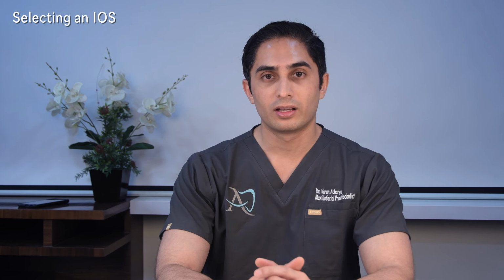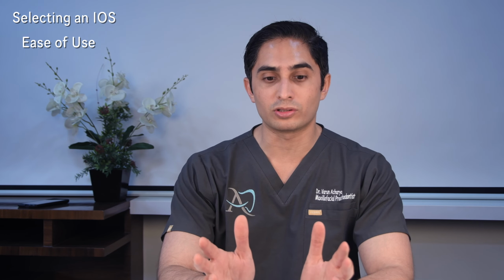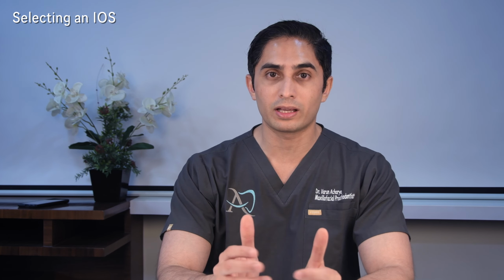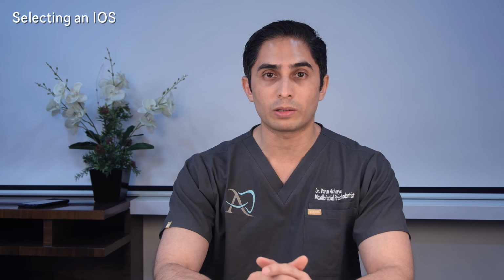But let's look at how you go about selecting an intraoral scanner if you feel it's right for your practice. First, let's look at the ease of use. Now, the ease of use has various components to it, mainly the size and the weight, right? The bigger the scanner, the more difficult it's going to be. With many scanners on the market, you're going to find trouble reaching the second molar for a patient with restricted mouth opening. And with most scanners, you're going to find trouble reaching the third molar. Even with adequate mouth opening, it can sometimes be challenging because the head of the scanner is quite big.